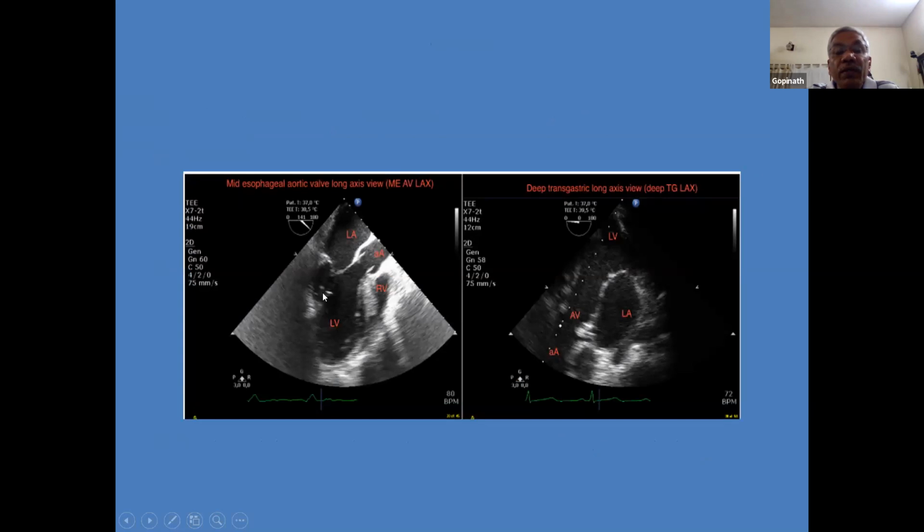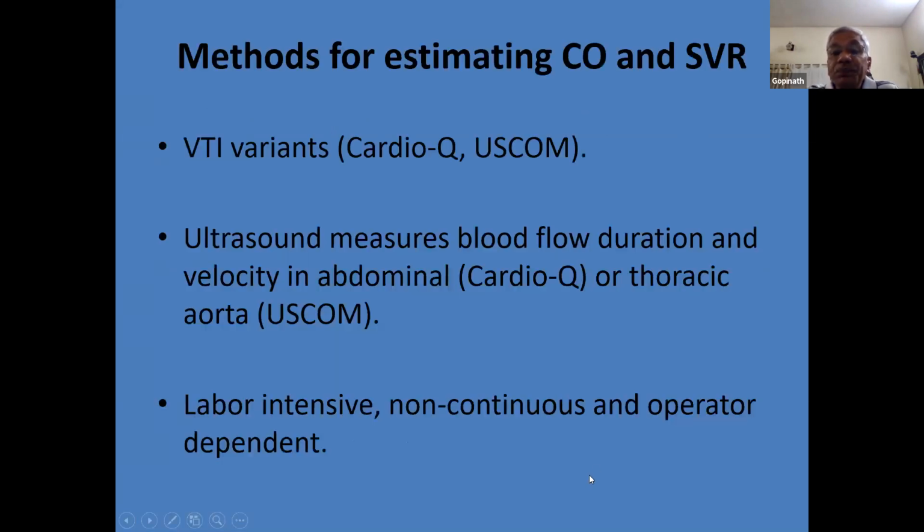I don't have loops, because I didn't put in any loops. So this is almost like a parasternal view from the other side, and the deep transgastric views.